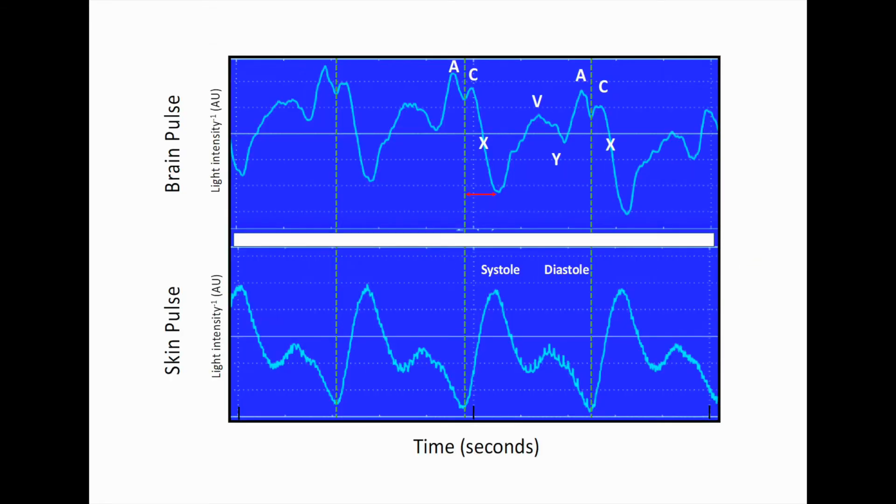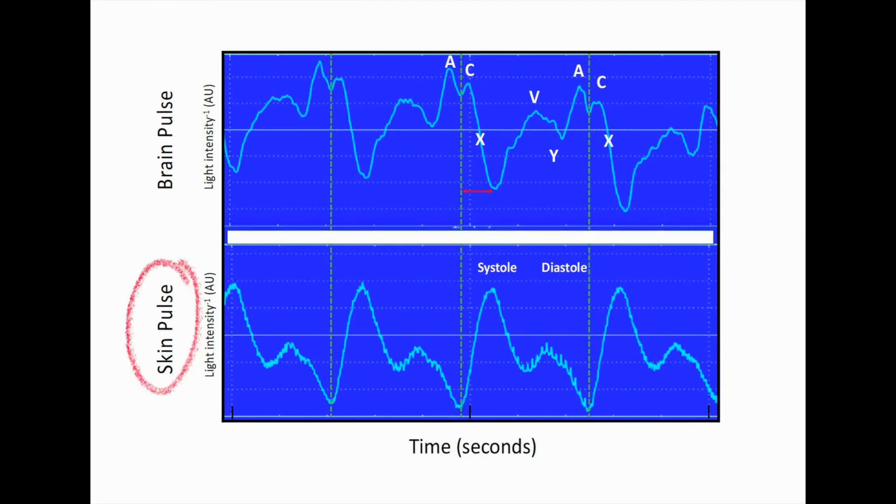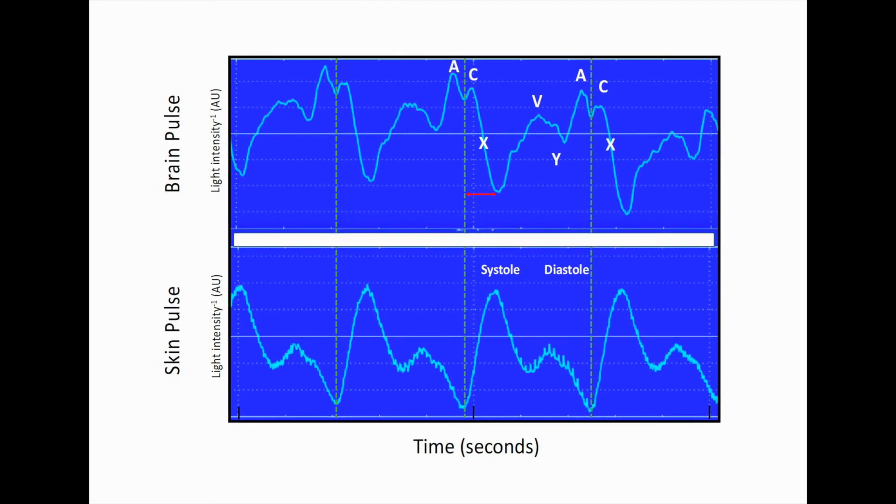This figure demonstrates a simultaneous recording of a normal brain waveform and the skin pulse waveform. As you can see, the shape of the brain pulse waveform is quite different to that of the skin. In fact, it is very much like a central venous pressure waveform with similar timing of the peaks and troughs.